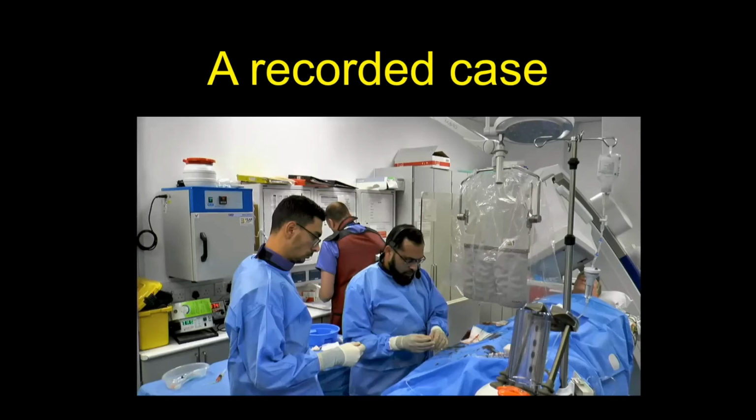The ones that we are saying is, how many of these cases where a patient comes with a STEMI and we don't stent it? Maybe 2 or 3 cases a year. So you are absolutely right, in 99% of the cases it's wire, balloon, stent. But in some, for example, this is just a plaque erosion and there's no stenosis, no residual disease there. These are the ones that you may want to leave alone. And many times when we are not doing the imaging anyway, we wire it and we see some flow achieved. Some people will just go for a stent. I might use a very small balloon just to achieve some flow and then put the stent there.